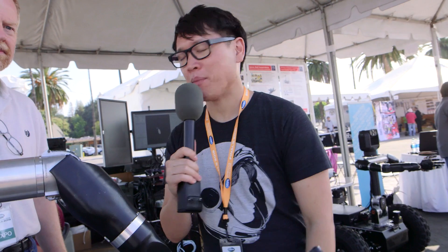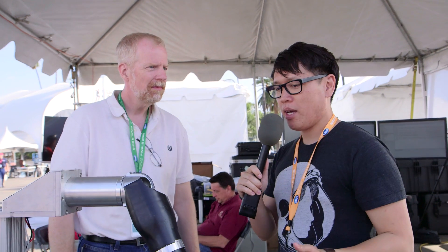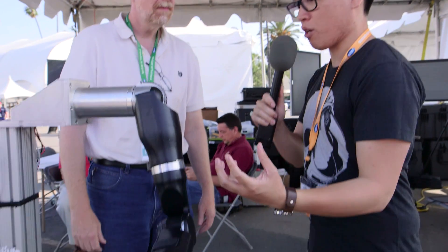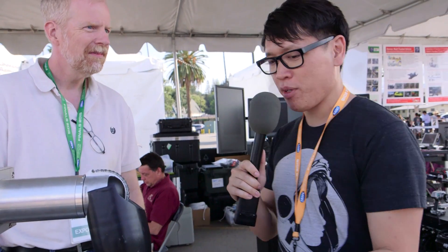Hey, this is Norm from Tested.com. I'm here joined by Mike McLaughlin. You're the chief engineer at the Johns Hopkins Applied Physics Lab, and you and your team have made this robotic arm. It doesn't look like a claw — it looks almost like a human hand. Can you tell me about the research that went into this arm?